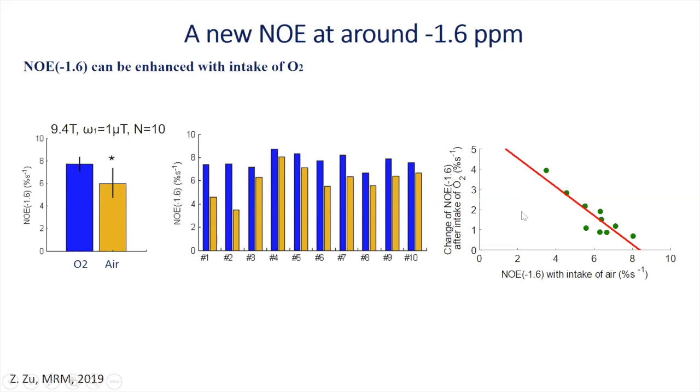Currently we still do not know the mechanism. We're still working on that, but the enhancement with oxygen may be the reason why we were the first to report this signal. I have asked people in several institutes, and I know that in their preclinical studies, they use air for maintenance. But in our institute, we usually use oxygen. So I think that's why we found the clear dip.